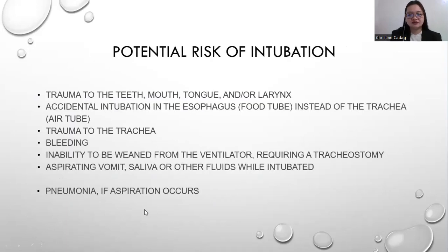Okay, next, potential risks of intubation. Trauma to the teeth, mouth, tongue, and/or larynx. So before intubation, you need to check if the patient is wearing dentures and if there's any loose tooth. You need to remove the loose tooth ahead of time so that it will not get dislodged and block the airway.